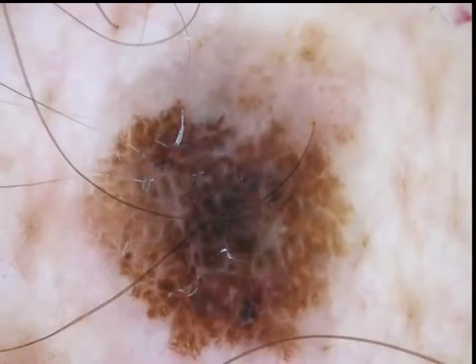What can we see here? There is the clue of white reticular lines. The white lines are arranged in a reticular pattern, so this is specific to melanoma. You will not find this in a BCC. So the diagnosis is melanoma.